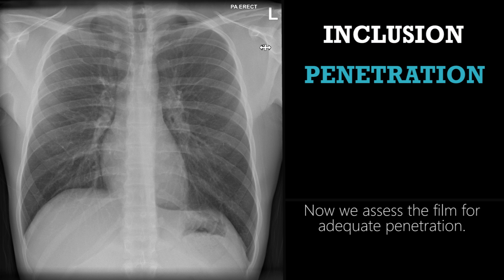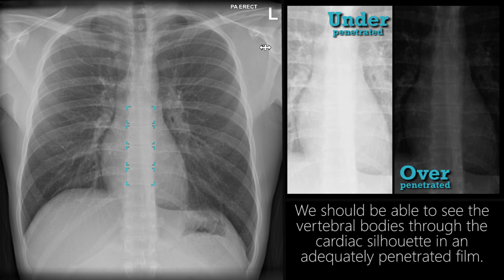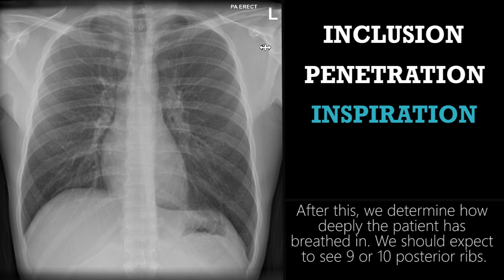We now assess the film for adequate penetration. We should be able to see the vertebral bodies through the cardiac silhouette in an adequately penetrated film. After this, we determine how deeply the patient has breathed in. We should expect to see nine or ten posterior ribs.